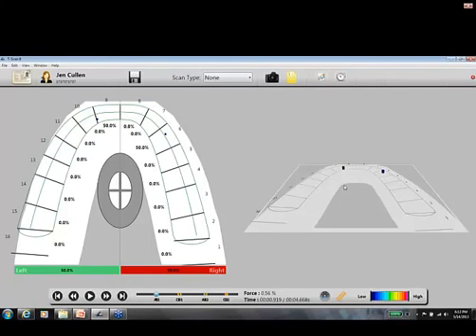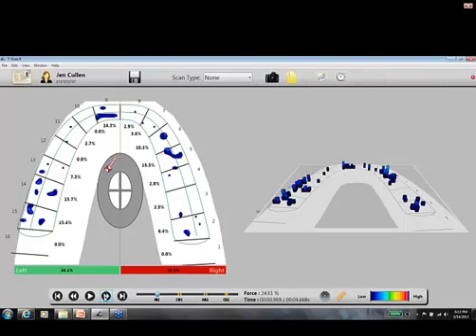And so what we're looking for is through time, we're looking to see how things come together. So you guys can tell me how bad my bite is. And so you see when I come into my bite, it looks pretty well balanced. I've got good contacts coming in on both sides, 55% of force on the left and 44 on the right.